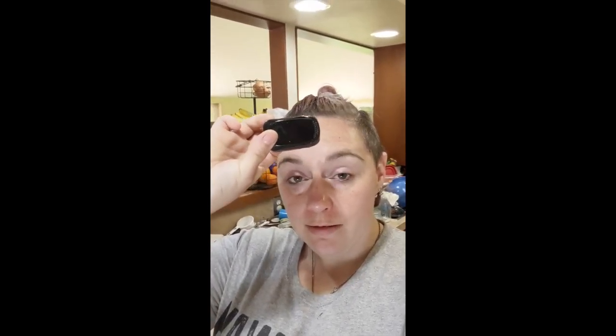Hi everybody! I have borrowed a pulse oximeter which measures oxygen levels in the blood. I am going to test my O2 level, show you the beginning result, and then I'm going to wear my mask pretty much all day, taking it every hour or so, and we'll see what happens.